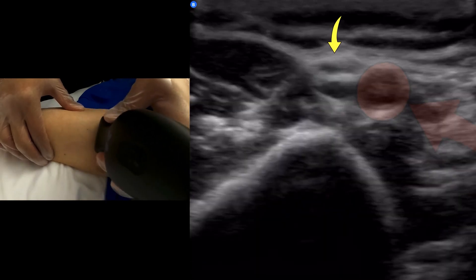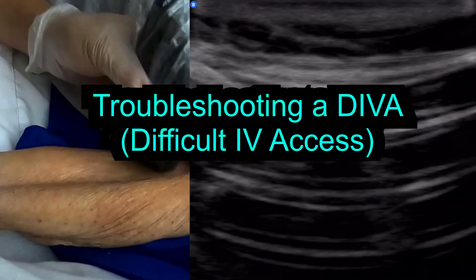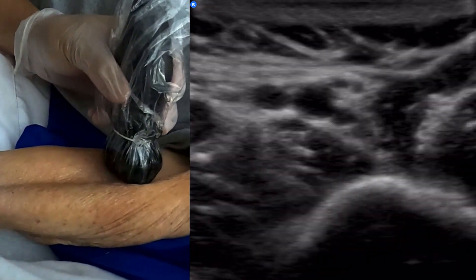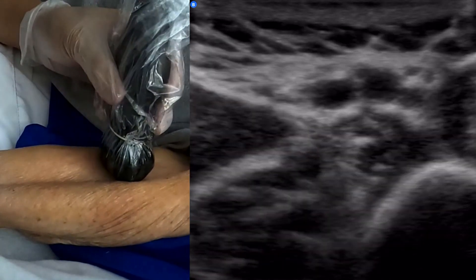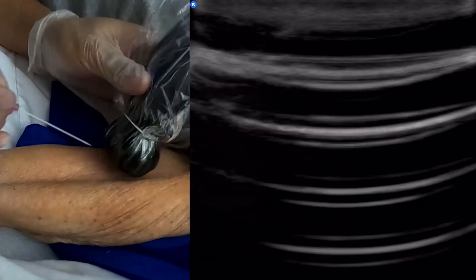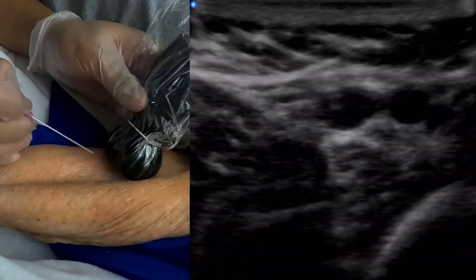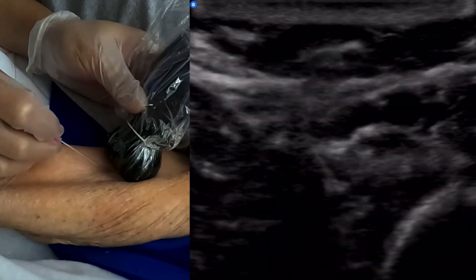I didn't like how that nerve bundle was right on top of that vein, so I decided to look in the other arm. There we go — that's where I want to tap. I'm going to go through there. Okay, here we go. Are you ready for a quick big stick? Alright, I'm going to put a needle in, but I need you to not move. Three, two, one — stick.